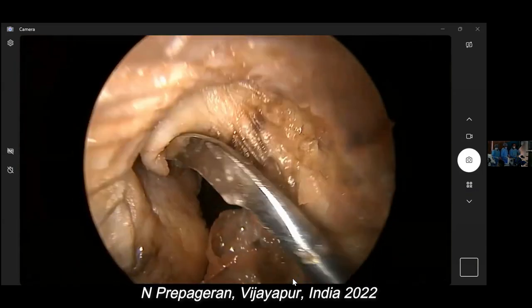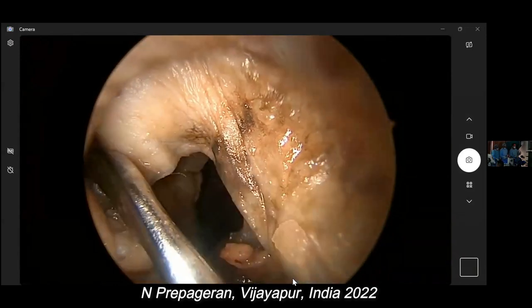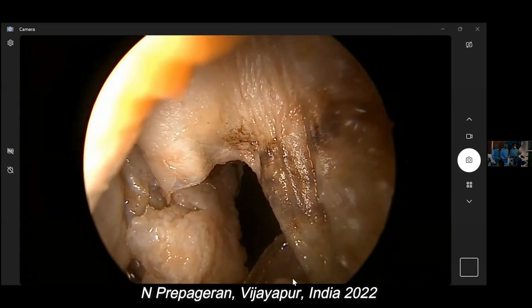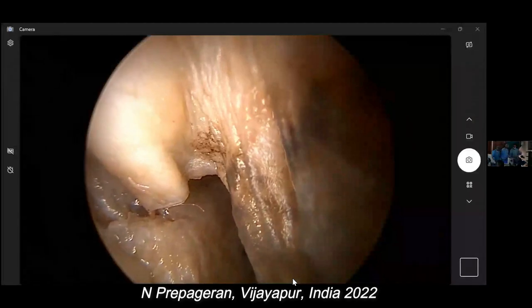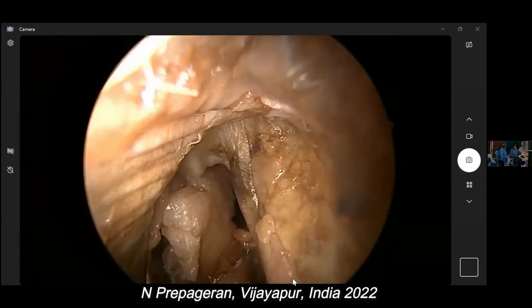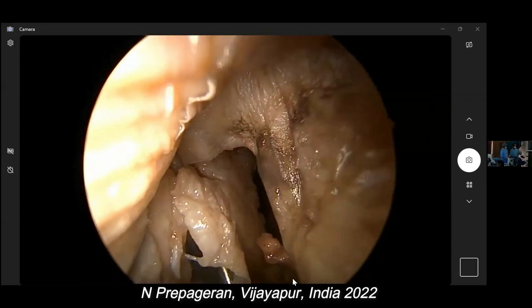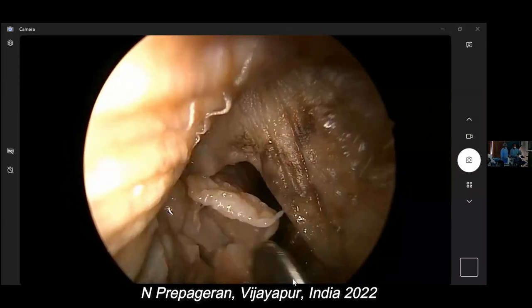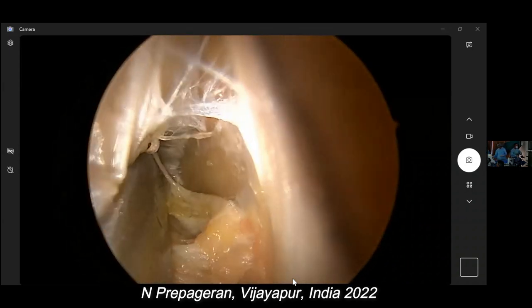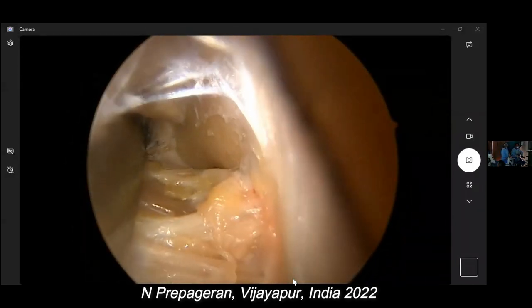So what we need to do now is to find the anterior wall of maxilla. But it's good for you to see me doing a difficult dissection, then it'll be easy for you. This elevator. Because you need a chisel and a hammer, you have a? Okay. Good. So now I'm going to dissect the anterior wall of maxilla. Okay, guys, can you see? You see the wall of maxilla? You can dissect until the infraorbital nerve. That's the infraorbital nerve coming into view.